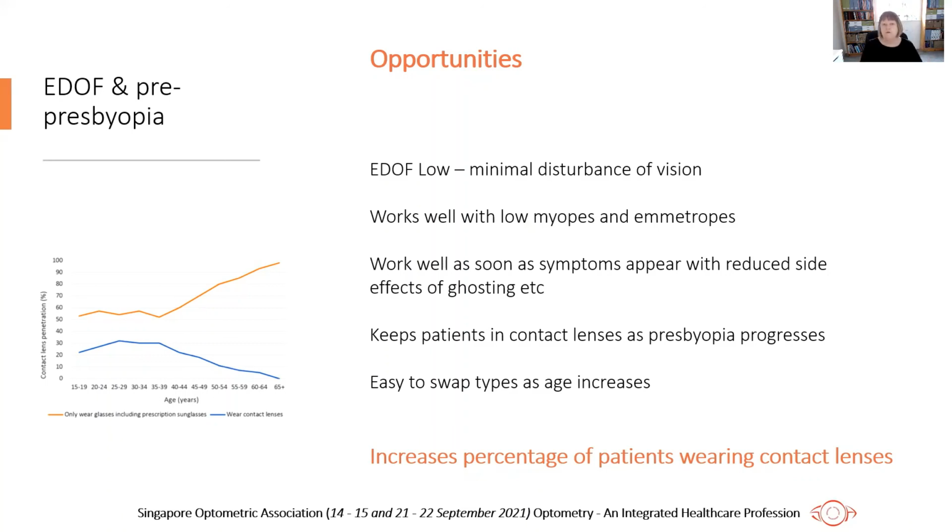You've then got hold of them and are able to set them onto the path of presbyopic contact lens wear for the rest of their life. So basically, these EDOF type lenses are a really good opportunity to capture the patients at that point in time when they're likely to drop out, and overall will increase the percentage of patients wearing contact lenses, so you can sell them contact lenses as well as spectacles.